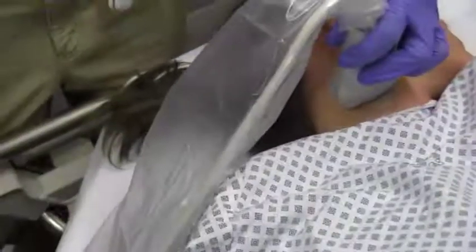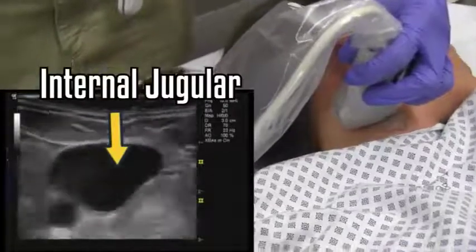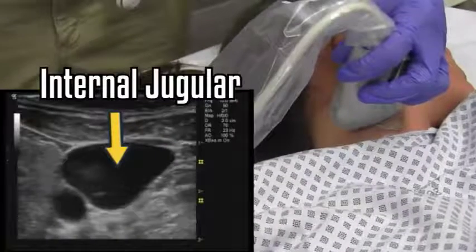In this case, we're performing an IJ. Using a transverse orientation, I will put the IJ in the center of the screen. This tells me that if I place the needle directly in the center of my probe behind it, I will likely be directly over the IJ. Please see the One Minute Ultrasound for central line placement and specifically the IJ for further information.